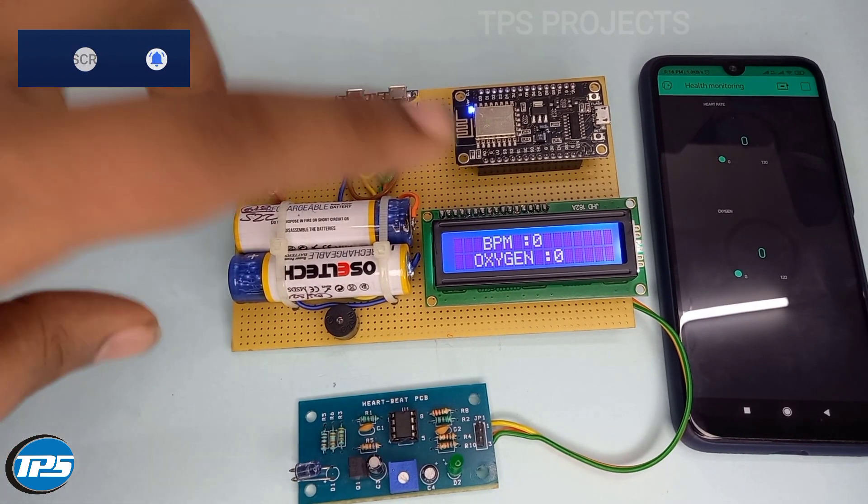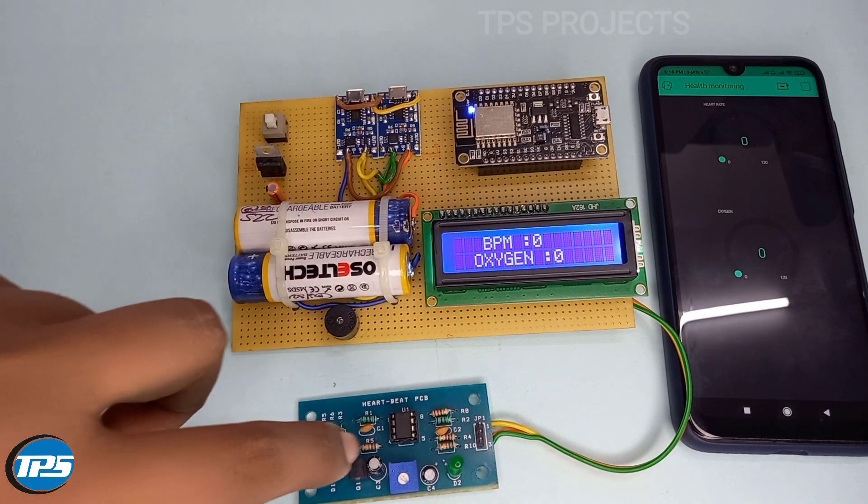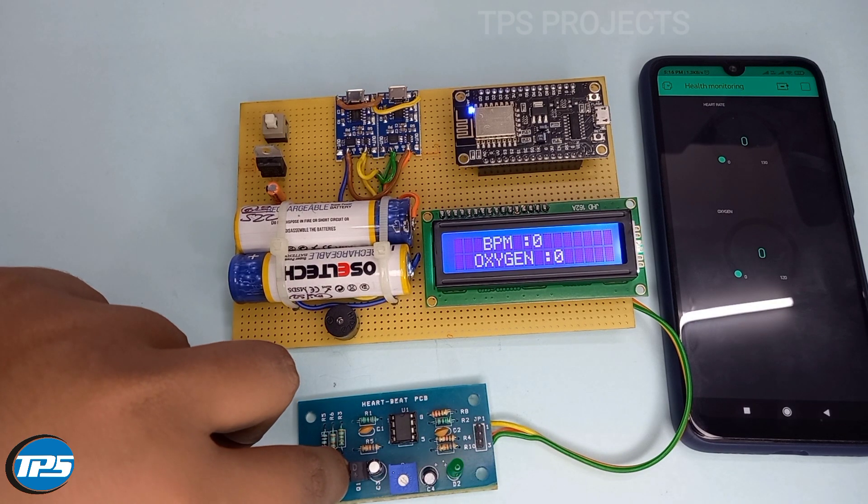Now I remove my hand and its oxygen and heartbeat level goes to zero. Now I am taking the reading again — it takes 30 seconds for reading.